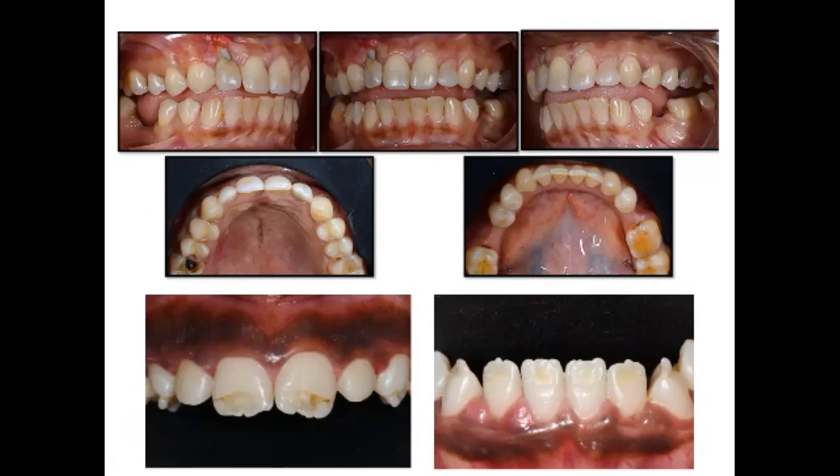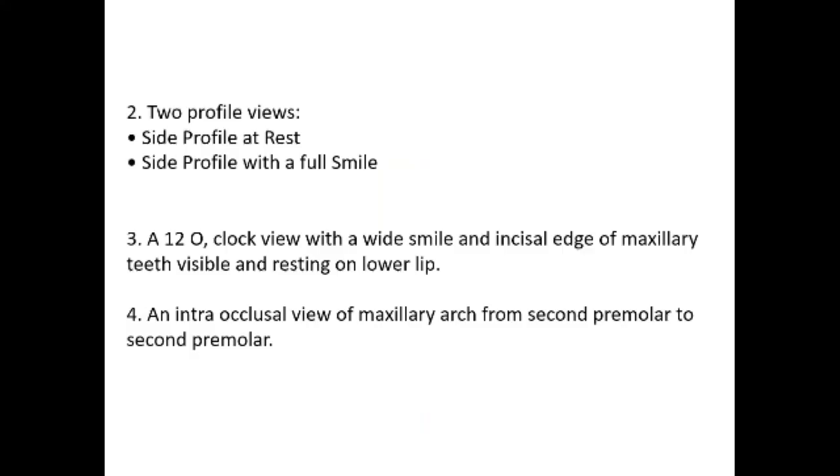photographs. We need intraoral photographs at 1:3 magnification in a crop factor camera, and 1:2 ratio in a full frame camera. And these are the intraoral pictures that we need. So straight on, left lateral, right lateral with slightly teeth apart, and upper and lower occlusal, and upper and lower anterior teeth with the contraster in place, and 2 profile views we need.